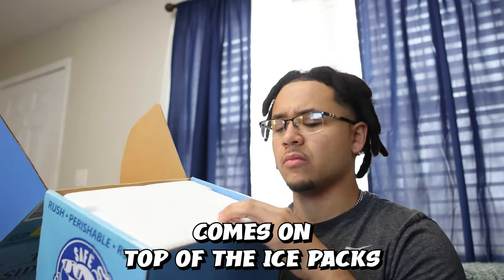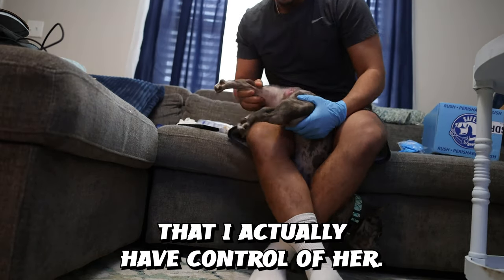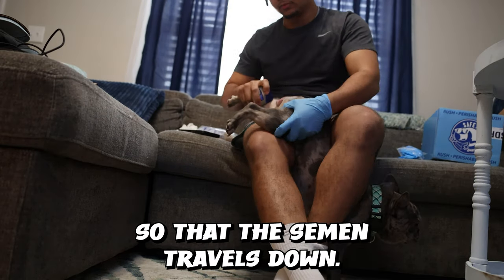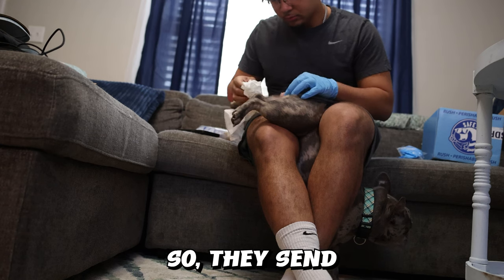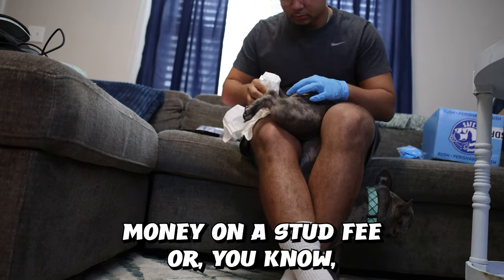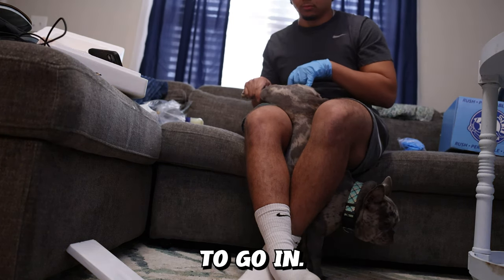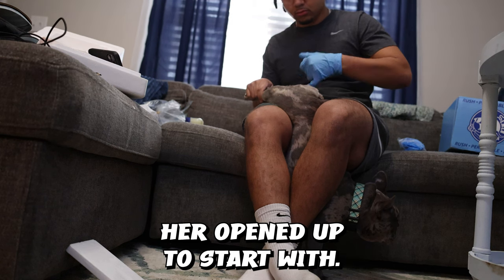This is just some polystyrene that comes on top — the ice pack sits in between that and the actual collection. Here you'll see me holding her up in this position, making sure I have control of her because sometimes they can squirm. Once I started rubbing her stomach she got more comfortable in this position. The reason for holding her up like this is so that the semen travels down and gets inside of her well. This is me putting Vaseline onto her vulva to prep the area for the AI rod. This makes the rod go in nice and smooth with no pain for her and gets her opened up to start with.